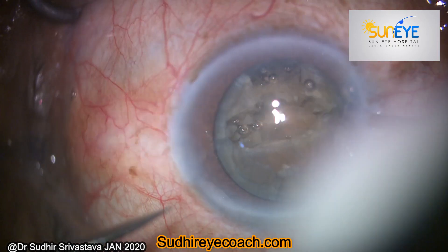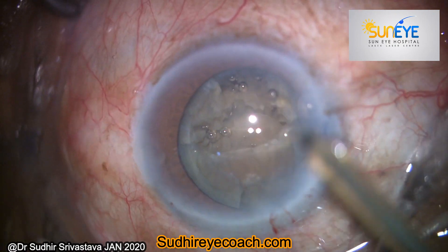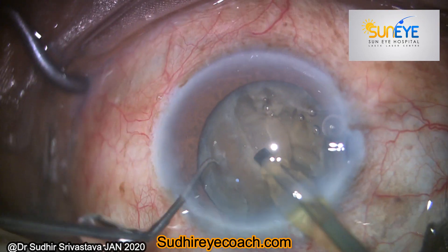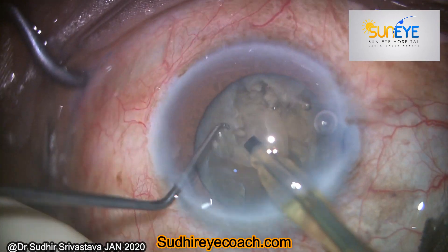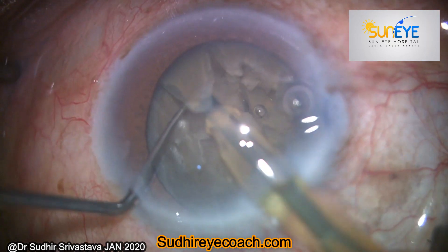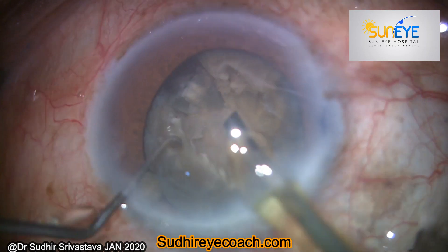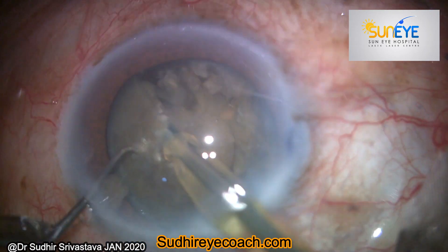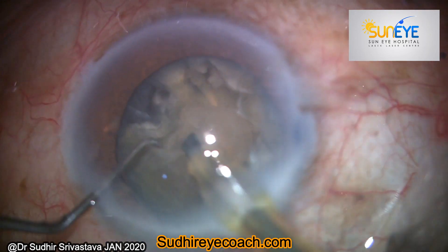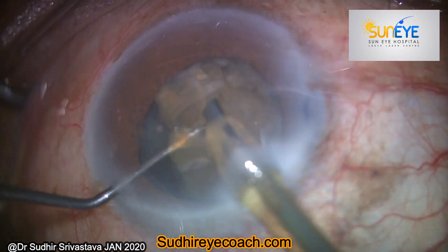So I filled the chamber again with viscoelastic and prepared another side port incision. This time I made a small size side port incision, and now you can see the difference. For safe surgery and safe phacoemulsification, not only do we need a good non-leaking main clear corneal incision, but we also require non-leaking side port incisions.